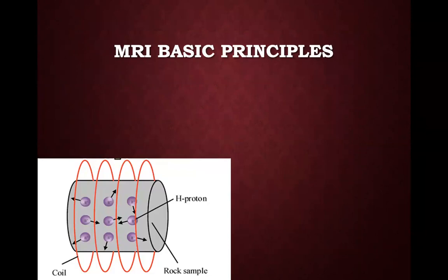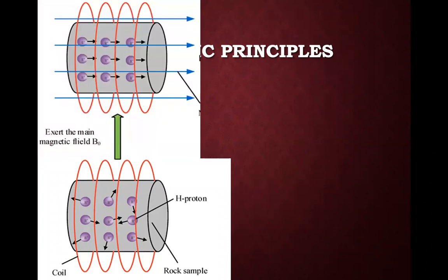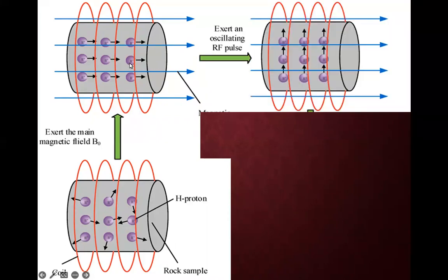Yeah, we have a block of tissue in which the atoms are all aligned in different directions, and we then introduce an external magnet with a magnetic field B0, either, like I said, a 1.5 Tesla magnet, 3 Tesla magnet, whatnot. Then all of them are aligned in a direction parallel to it. Then what happens is when we introduce a radio frequency pulse, this is the tuck, tuck, tuck sound that we hear in the MRI.